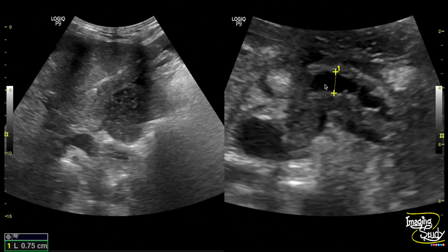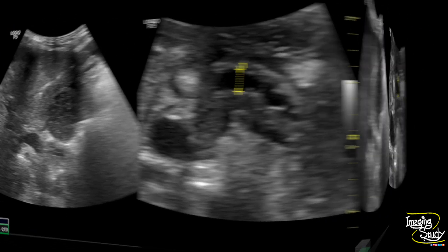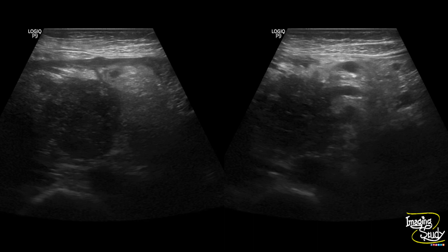On the right image you can see the dilated main pancreatic duct, and on the left image there is a glimpse of the gallbladder along with the heterogeneous liver parenchyma. Here is the linear transducer view showing the pancreatic mass lesion. This is the dilated main pancreatic duct, and you can see the normal pancreatic tissue is much brighter than the mass lesion.